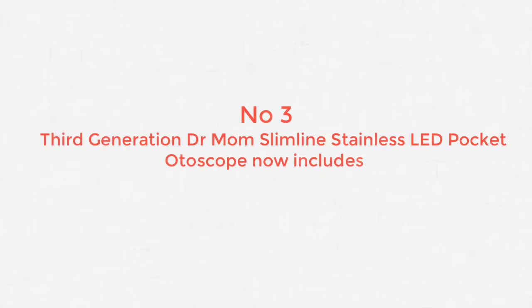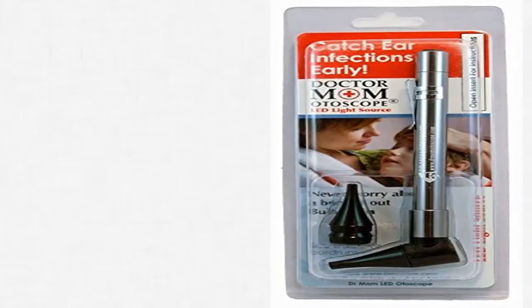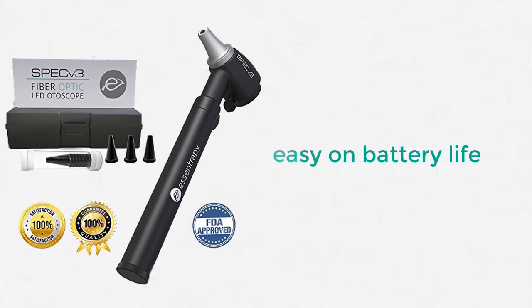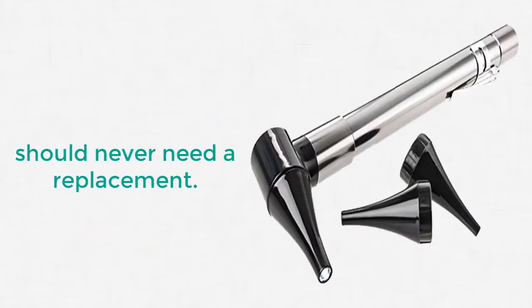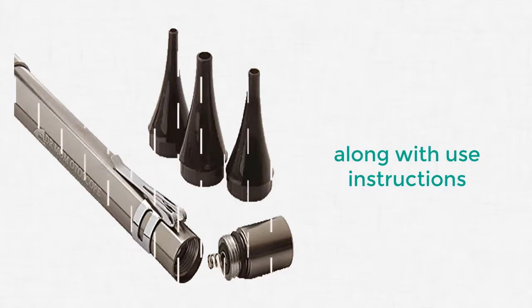Number 3: 3rd Generation Dr. Mom Slimline Stainless LED Pocket Otoscope. Be fully prepared for your kids' ear emergencies with the 3rd Generation Dr. Mom LED Otoscope. Not all otoscopes are created equal, so be sure to choose wisely. Stop wasting tons of money on unreliable otoscopes that either don't work or are difficult to use.